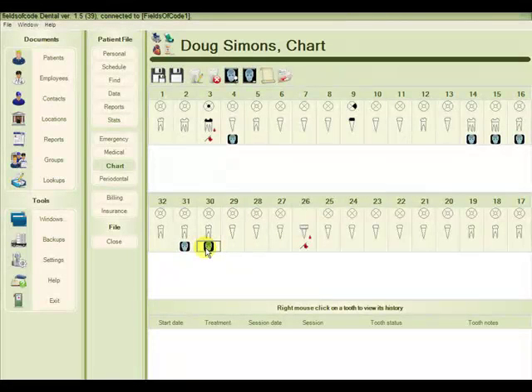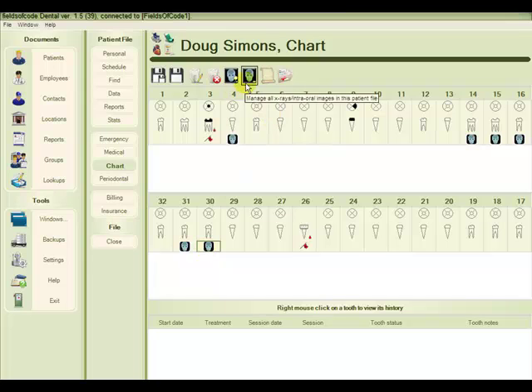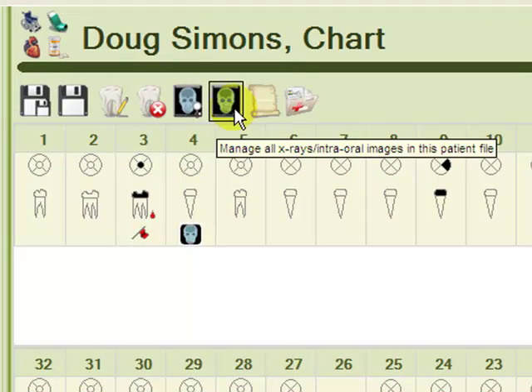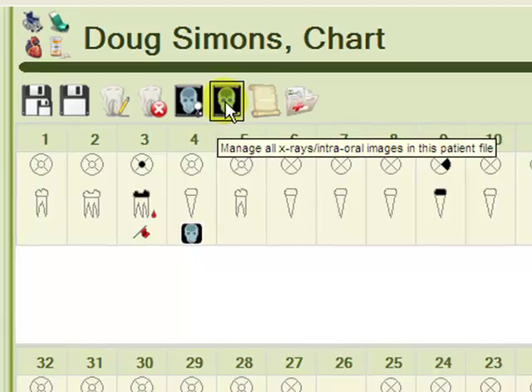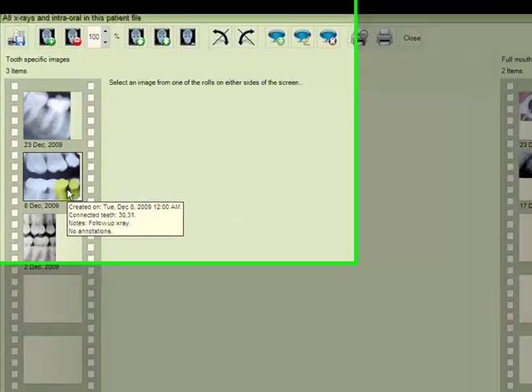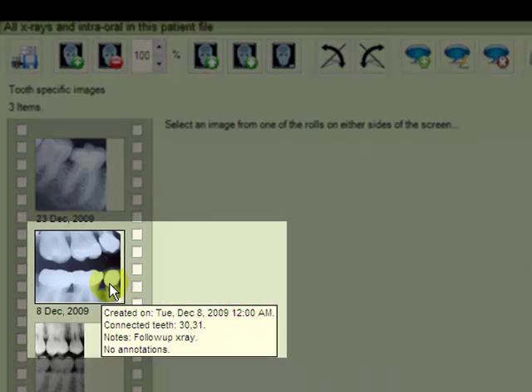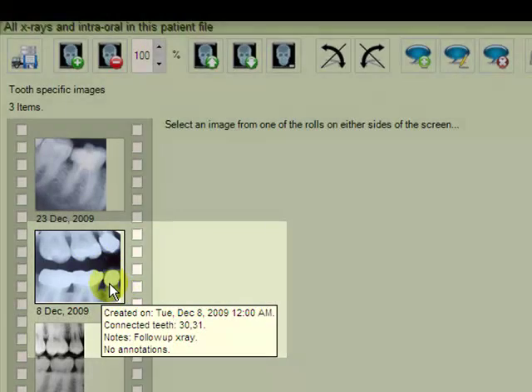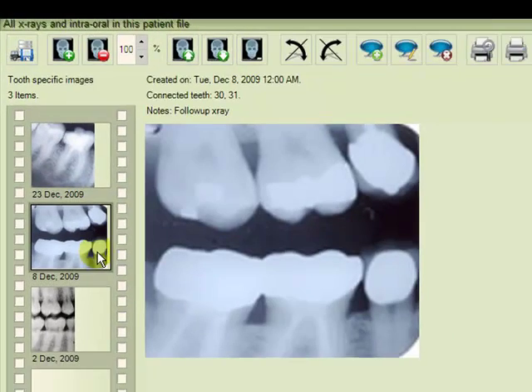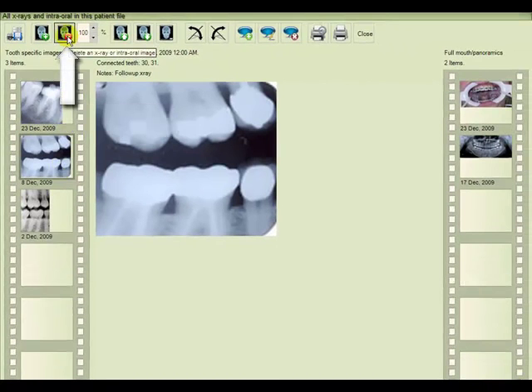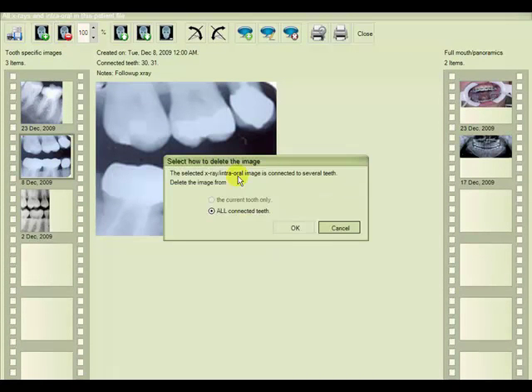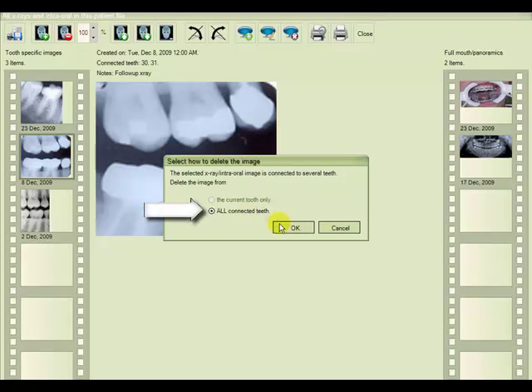However, if we wanted to remove this X-ray entirely from the Fields of Code database, we would choose manage all X-rays in this patient's file. Choose the X-ray image which we see here is connected to teeth 30 and 31. Delete the X-ray from the top toolbar. And now remember in this view, we are only allowed to delete it from all connected teeth. And doing this will delete the image completely from the database.